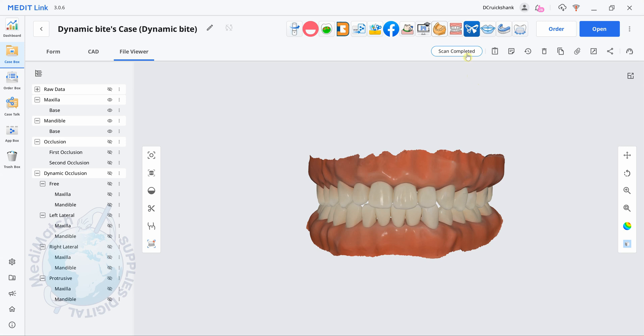Okay so here we are back in MeditLink. The case has processed and we're now at scan completed. And you can see under dynamic occlusion in the file viewer we've got all of our movements recorded both for the upper and the lower. For free movement, lateral left, right and protrusive.